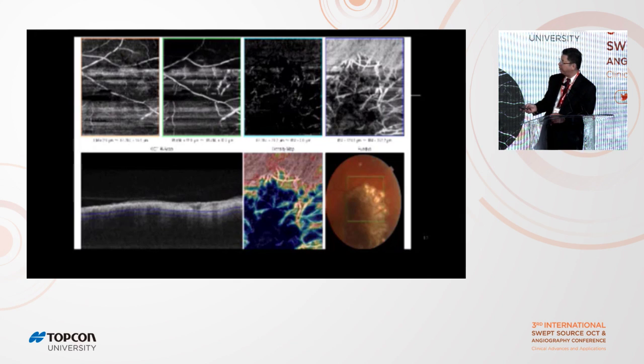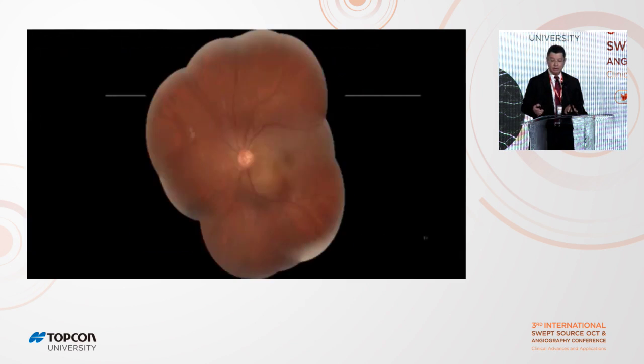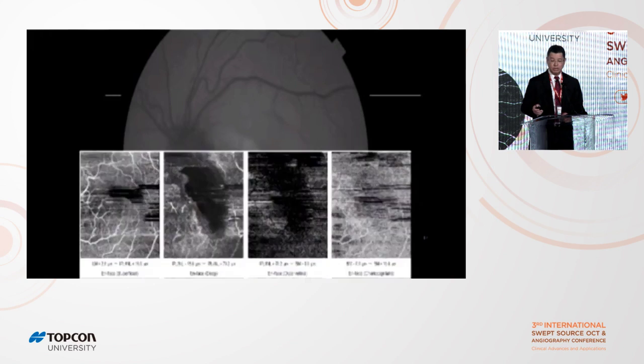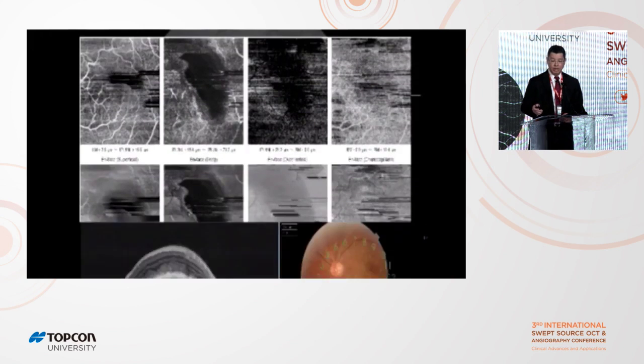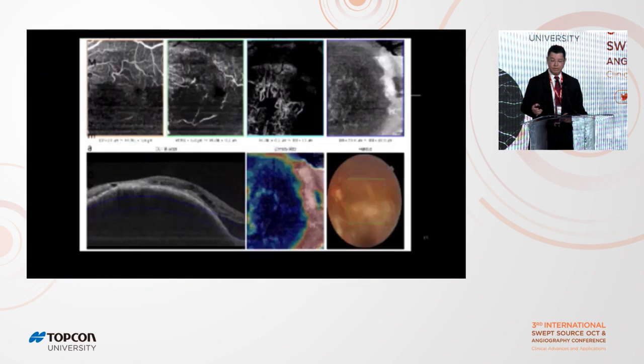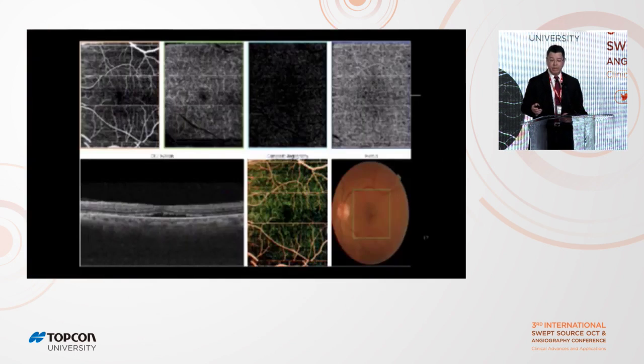And this hyperreflectivity of the vessels probably can again be correlated with prognosis. Again, the center tends to be more hyporeflective in these lesions. This is another lesion that shows hyperautofluorescence on the autofluorescence image. And here we see the lesion with subretinal fluid, the typical characteristics that we mentioned, and the vessels in the tumor. And then after treatment, the vessels will decrease in reflectivity because of the treatment.